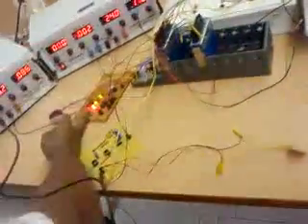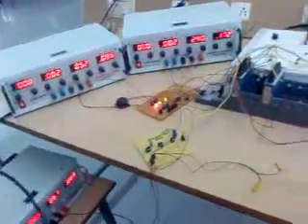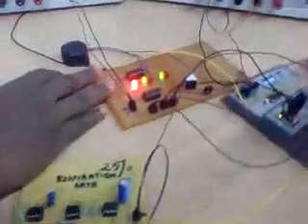the respiration rate is below 12, which is our threshold, and we can see the buzzer and the red abnormal light glowing. So this indicates to the people that there is an abnormal activity in the patient, and a physician can come and treat the patient. Similarly, when we simulate the heart rate below 50, you will have an abnormal heart rate shown, this green LED will turn red, and again the buzzer sounds.